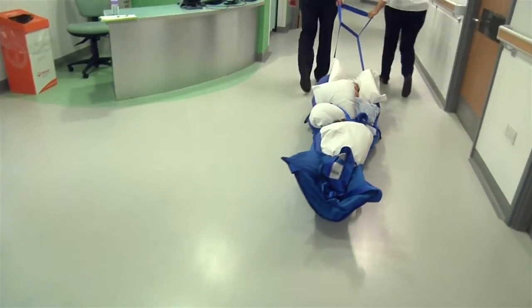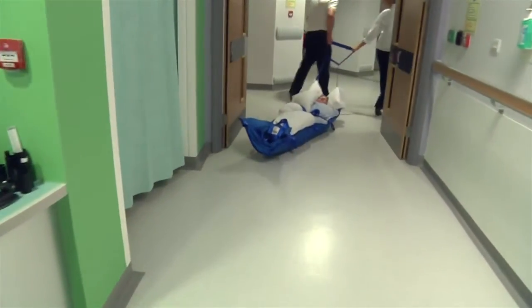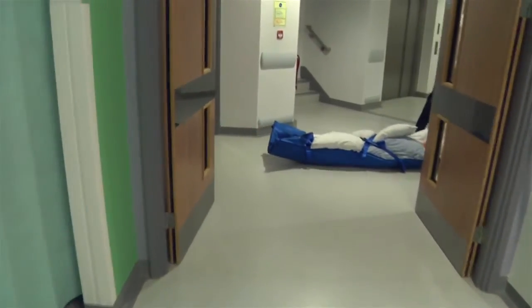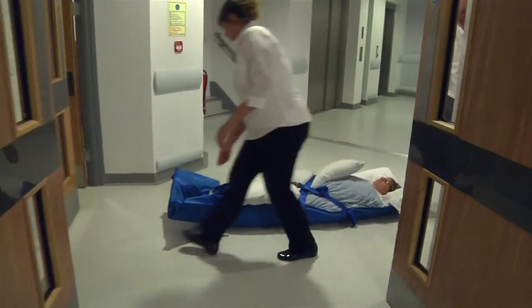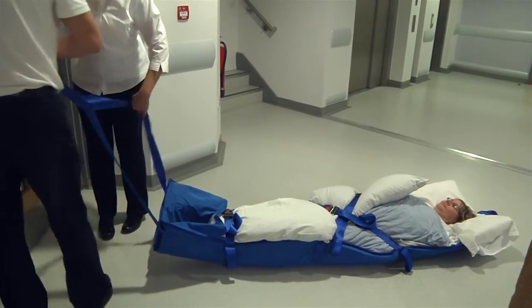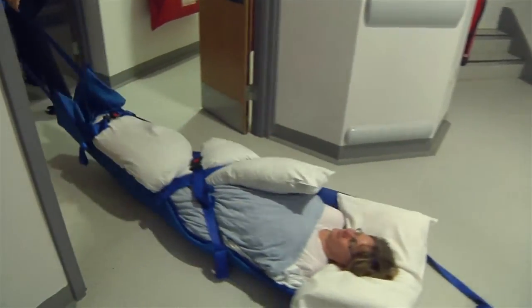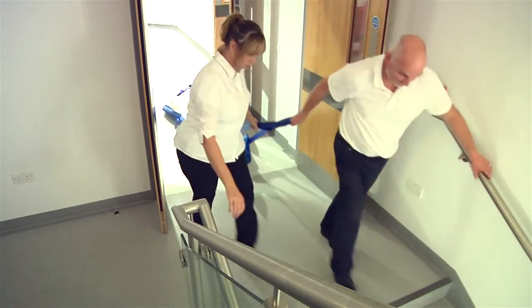If doors are to be negotiated, the ski sled should be pulled from the head end to avoid doors closing on the patient's head. However, it is vital that the patient approaches the stairs feet first, so be careful to ensure that turning the ski sled around in a narrow corridor is not required to achieve this feet-first position.